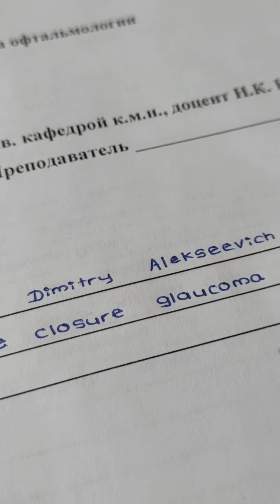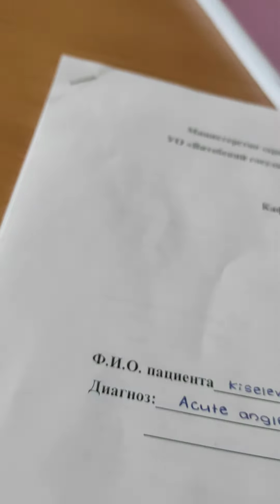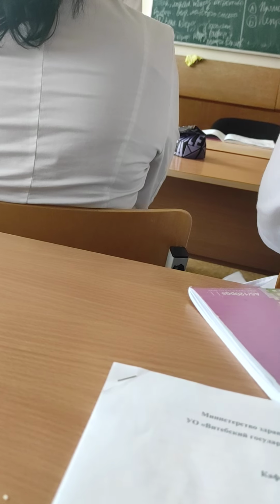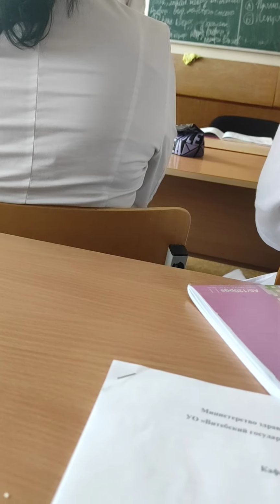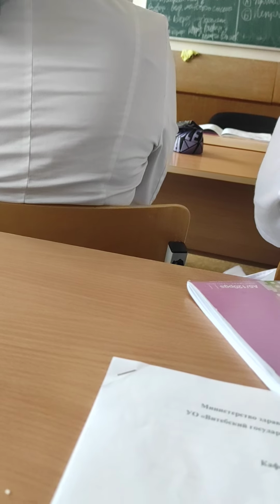So what you have to try to learn is how to see the red reflex. Everybody knows about red eyes in pictures. This is actually a red reflex from the eye fundus. The flash gets into the eye, is reflected from the eye fundus, and is seen in the picture and the photo after. So we need to see the same red reflex. We send the light inside of the eye. It reflects from the retina and gets out of the eye. What we do with the lens is focus this image into our eye to make the eye fundus visible.